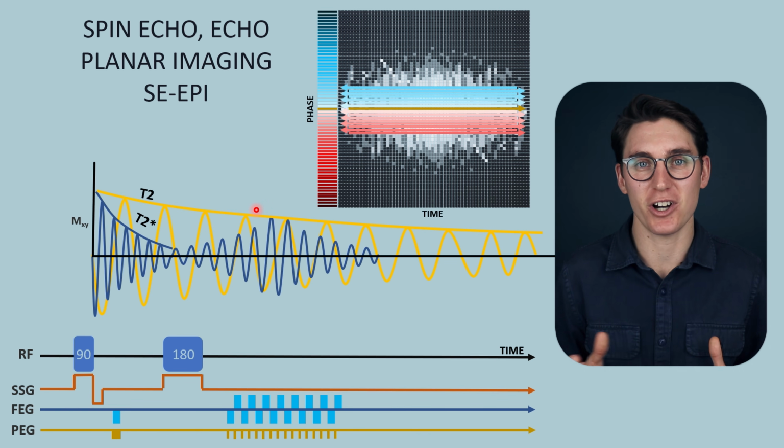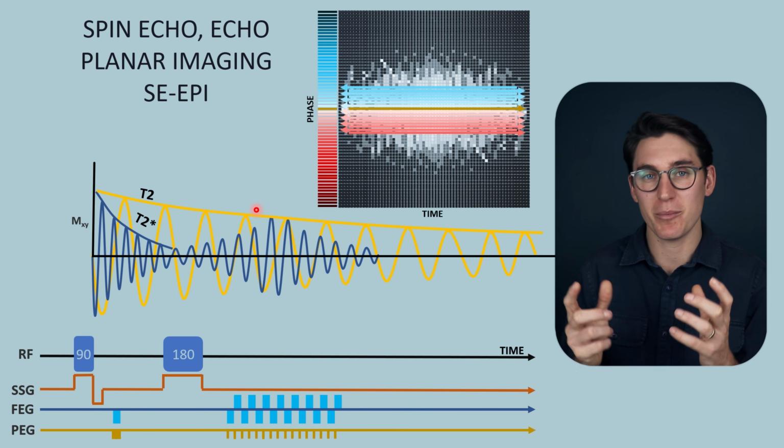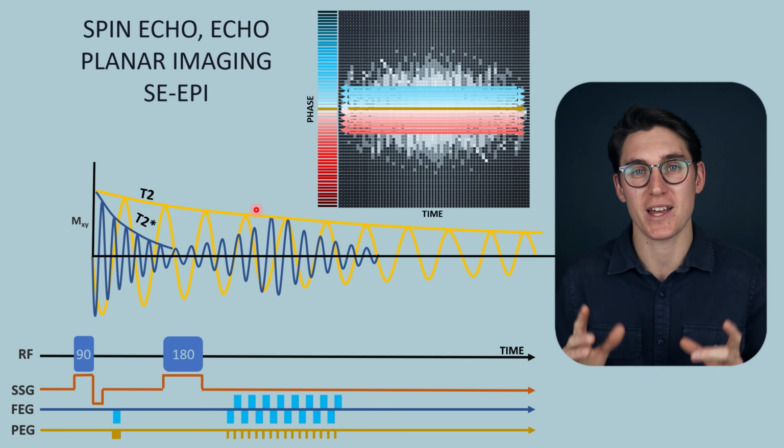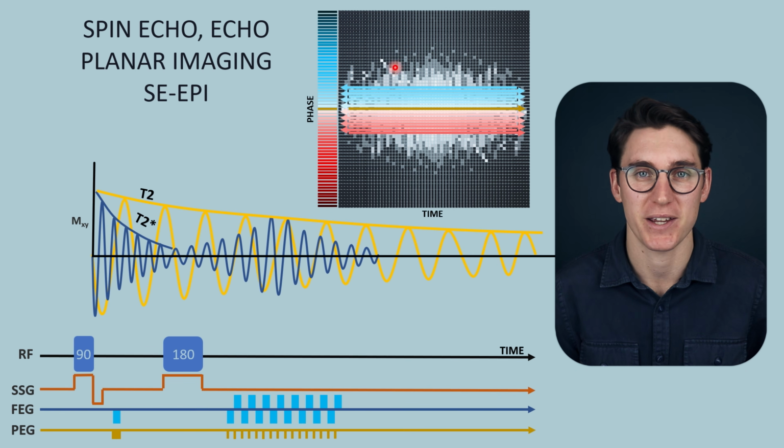You can see the advantage to this. You can rapidly reduce motion artifact. If you're trying to image, say, the heart, and you want to get a quick snapshot without getting all of that motion in here, we can do EPI imaging to rapidly fill K-space.